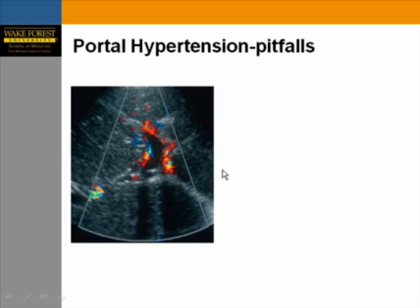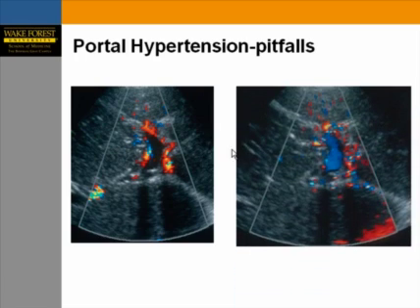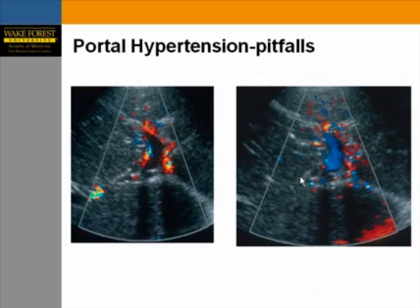Another patient with portal hypertension and cirrhosis: initially interrogated with a very high scale showing no evidence of flow, leading to an impression of complete occlusion of the left portal vein. Improving sensitivity demonstrates flow in the portal vein — but it is reversed. So this is portal hypertension, not portal vein thrombosis.